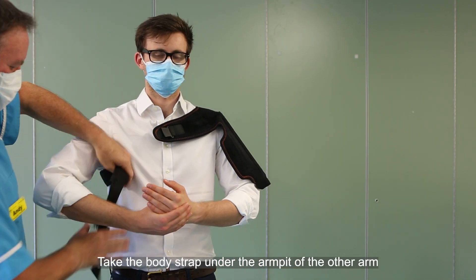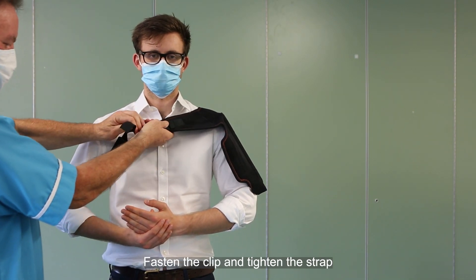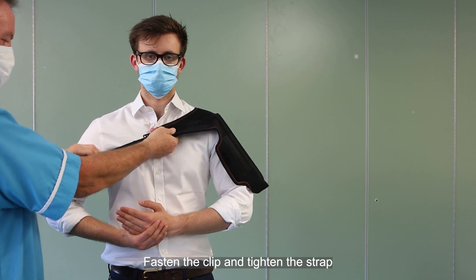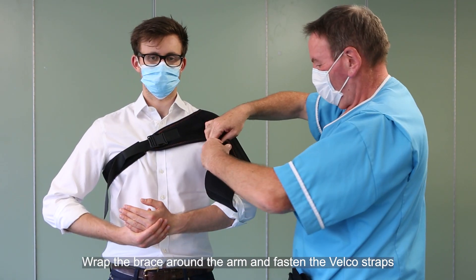Take the body strap under the armpit of the other arm. Fasten the clip and tighten the strap.